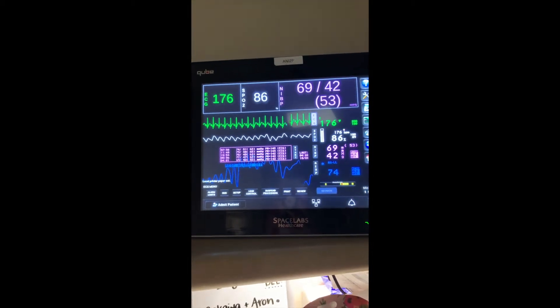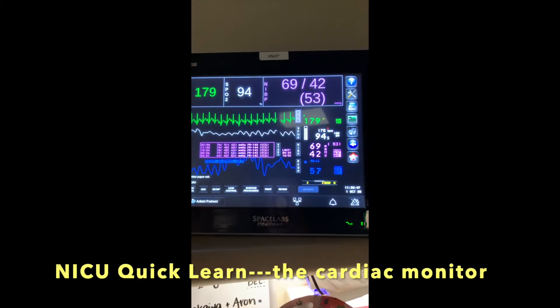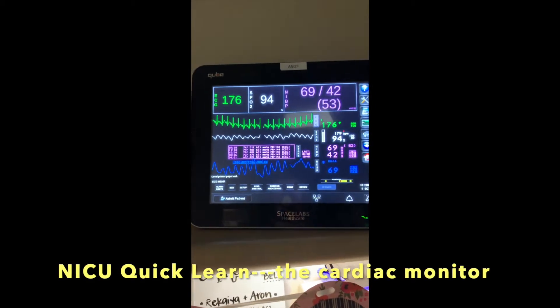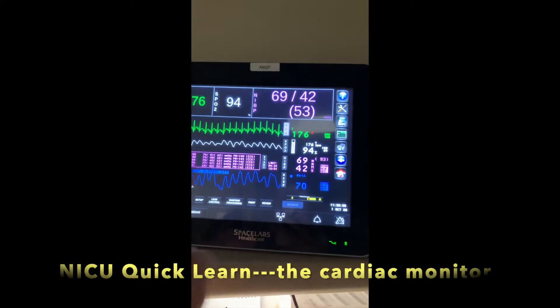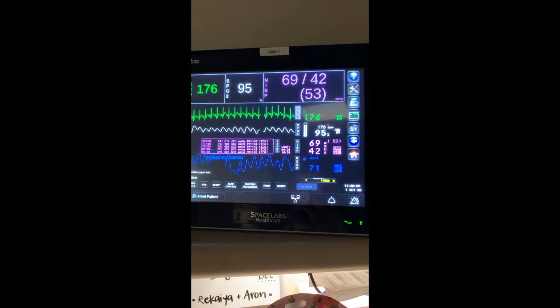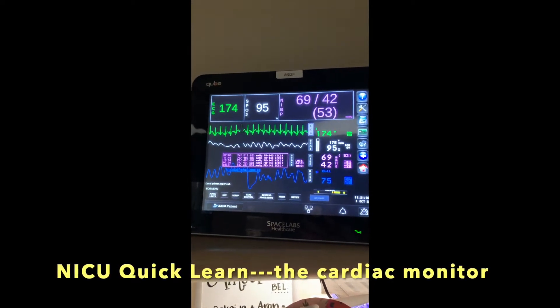Here is a cardiac monitor that you would see in a lot of patients in an ICU. The number here in the left upper corner is the heart rate — this is an elevated heart rate. The second number over here is the oxygen saturation. We always want to see oxygen saturation in the mid to high 90s.